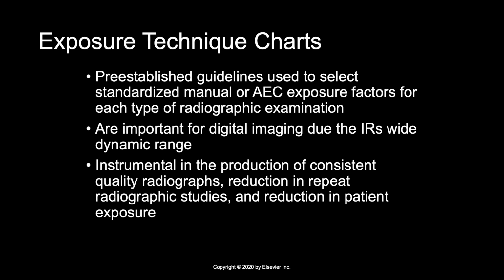But most of the time, places that you go are going to have an anatomically programmed technique. So everything will be programmed in the control console, and you really don't have to worry about setting your exposure factors. But this is good if you're using a portable machine, or if you have a patient that's extremely large or extremely small and you need to adjust it, then you need to know around about what the exposure factors are for each exam.